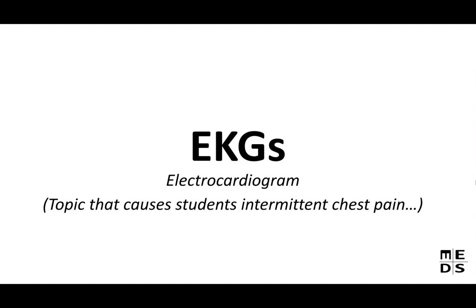Okay, so today's topic is going to be on EKGs. This is essentially just going to be an overview of the basics. There are a lot of other good videos on YouTube that go through this more in depth. I figured this was a good video to give you a basic understanding and a little bit of an overview of what EKGs are all about.